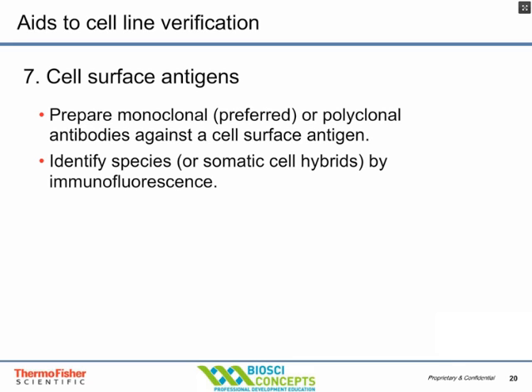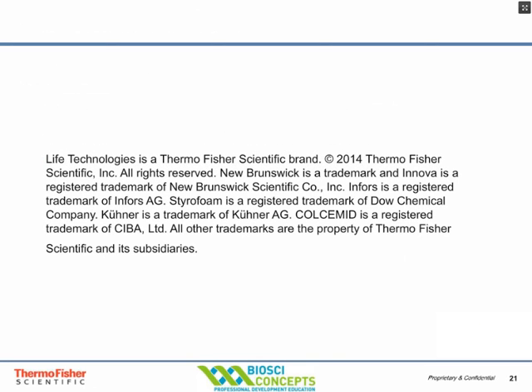Cell surface antigens are another good way to detect intra- or inter-species cross-contamination. Understanding the biology of the cells you're using is key — liver cells should have liver proteins, kidney cells should have kidney-specific cell surface antigens. Using monoclonal antibodies against specific cell surface antigens can determine intra- or inter-species cross-contamination, since chromosome and mitochondrial analyses alone can't distinguish, say, a human liver cell from a human kidney cell. You might also use biochemical assays. I hope this has been helpful — thank you for your participation.